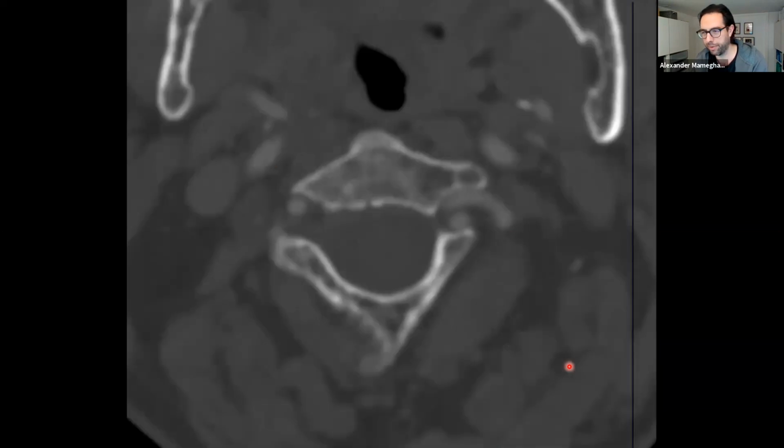So you see this loop on the left side in the foramen, and everybody here on the faculty or on the panel always says, do a CT scan in complex cervical spine, and you can see here very nicely how important it is. With screw placement, irritating a nerve root could be survivable. An irritation of the vertebral artery can lead to stroke and a fatal outcome.